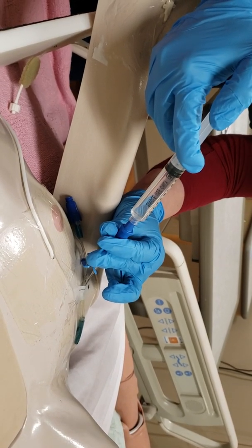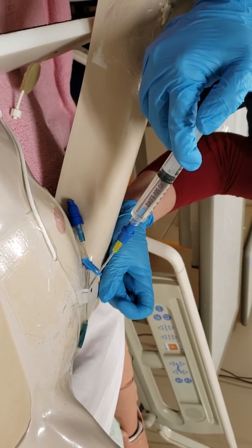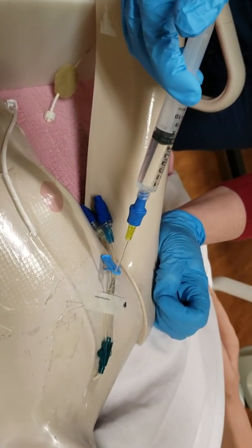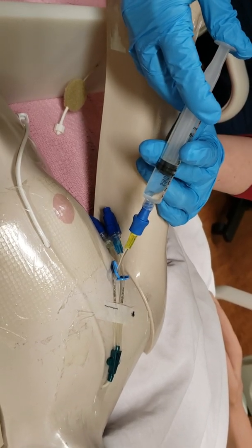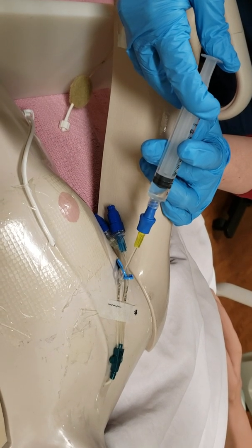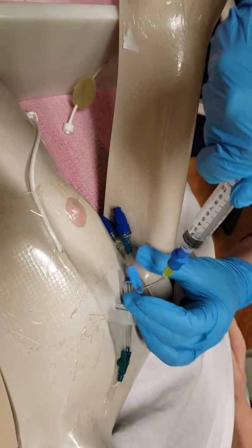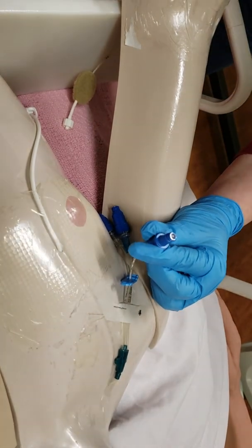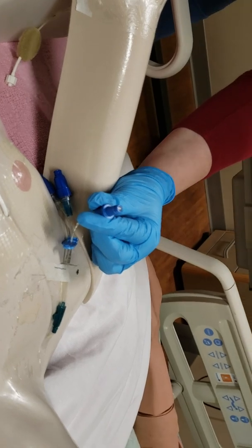Okay, I'm going to give a nice slow steady flush. I do not notice any infiltration. There's no bulging. My dressing is clean and clear of any redness. As I'm inserting this, I ask Mary if she has any pain or tenderness, if anything is bothering her. She says no. Okay, so before I remove my syringe, my flush, I'm going to close my clamp.